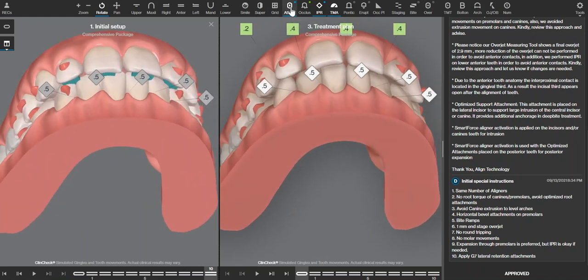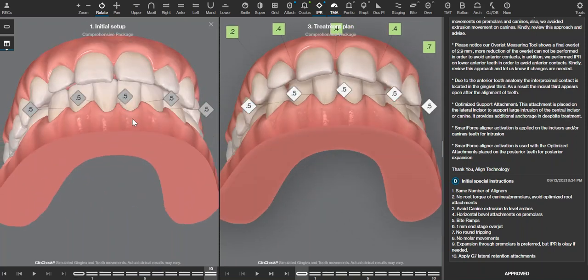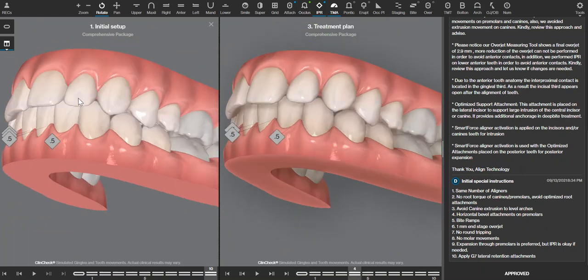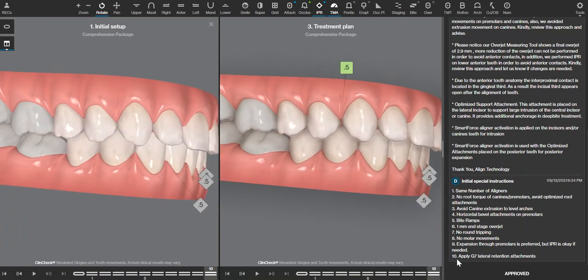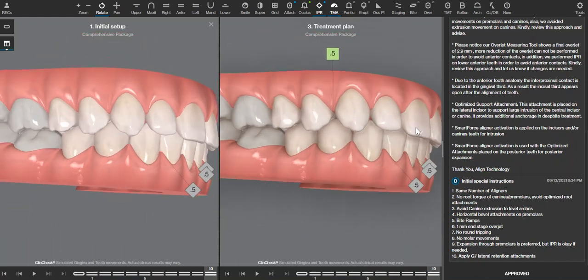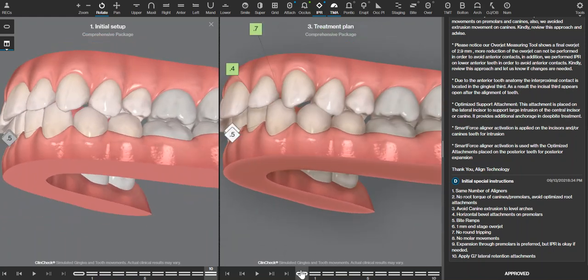This overjet at finish that we see on the left hand side is really tight. When you need to do lower IPR and intrude, it is very likely that these teeth may lag behind, and if they lag behind in the intrusion in any way, then these are going to finish with a posterior open bite. So one of the good things that I did is redistribute the space distal to the canines. So adding more space distal to the canines allows the patient to have a very aesthetic smile without having to risk a posterior open bite. Even with that space distal to the canines, the lower IPR is still needed so that we can finish with an adequate overjet to prevent posterior open bite.